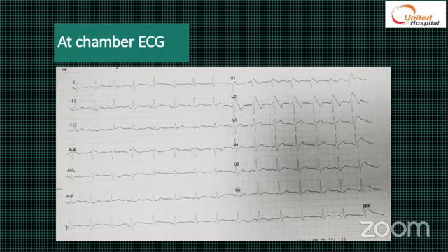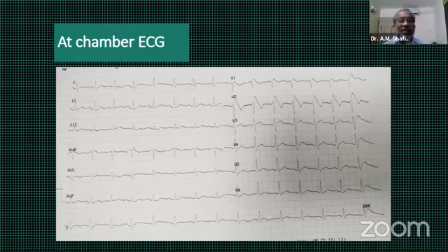if the family history is positive for premature coronary artery disease, or present for sudden cardiac death. Patient does not have any history of sudden cardiac death, and we did Holter ECG monitoring. We could not find any sort of arrhythmia during the 24-hour period, and the patient did not complain of any palpitation during the period.